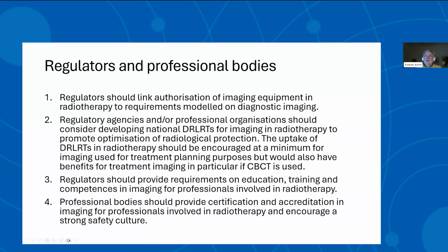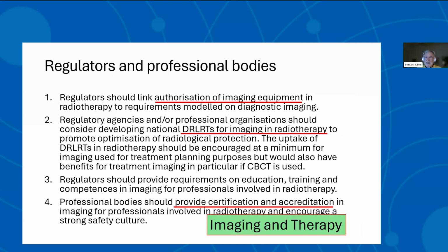And then finally, there are recommendations for regulators and professional bodies, which basically pertain to the fact that the regulators actually have also tools to try and optimize patient care in radiotherapy, patient care in this context, through the use of optimized imaging as such, which could be helped by providing authorization, by providing some certification and accreditation, and by using the same tools and making it compulsory to use the same tools we use in imaging, also in therapy.